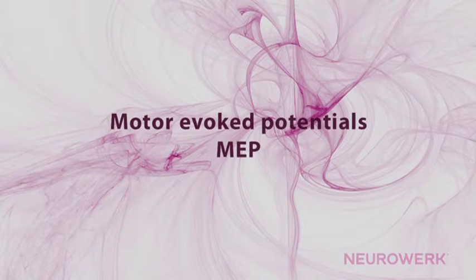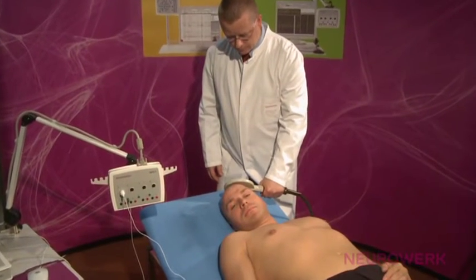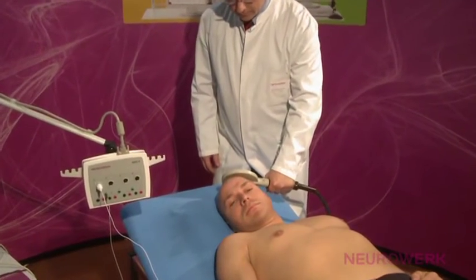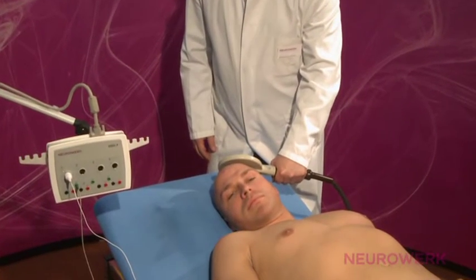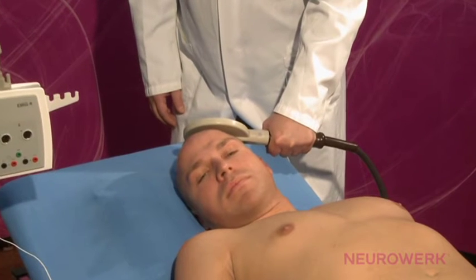Motor evoked potentials, MEP. The motor evoked potentials are shown here by using the example of the upper limb recording at the ulnar nerve. The measurement can take place while the patient is either sitting or lying down.